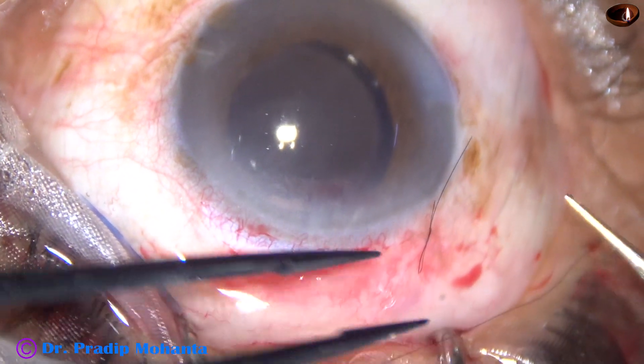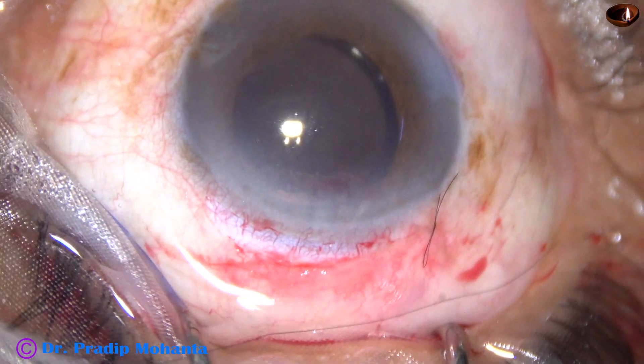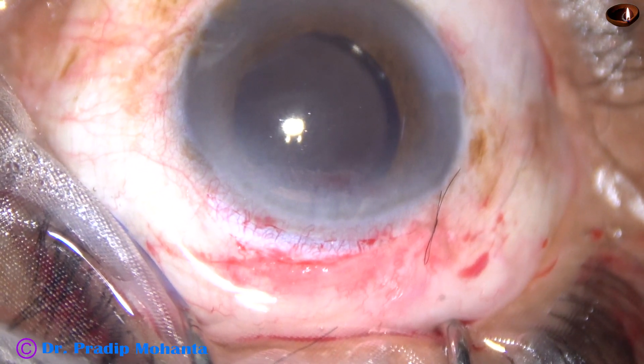You can cut the other thread, but keep it longer than this one. And you just have to pull the longer thread to remove it.